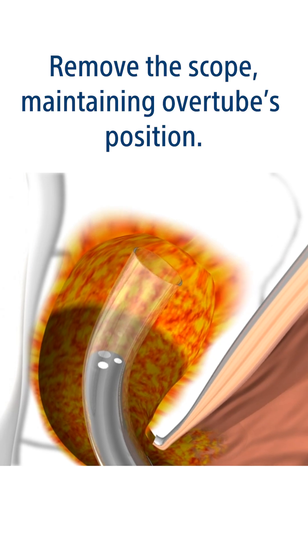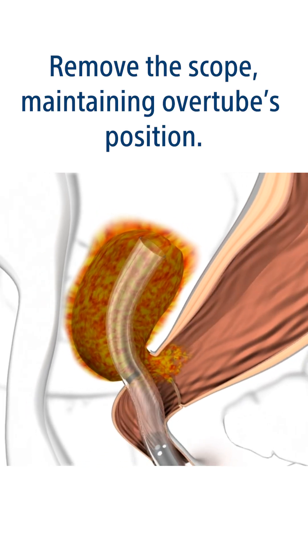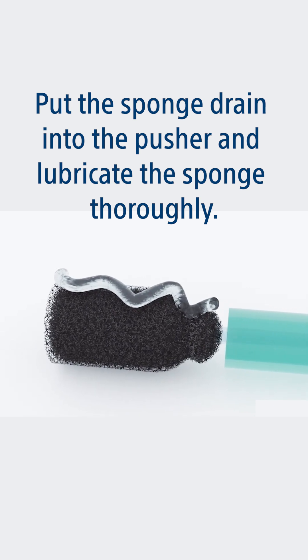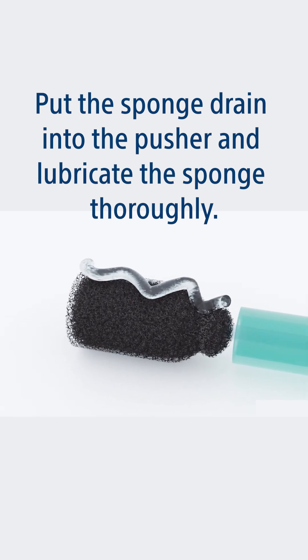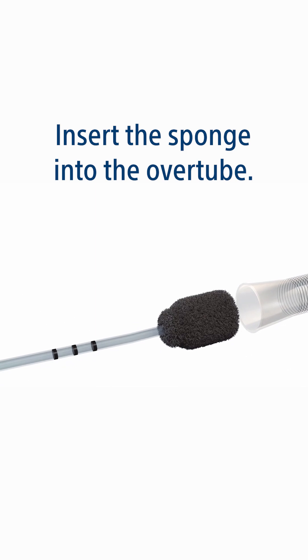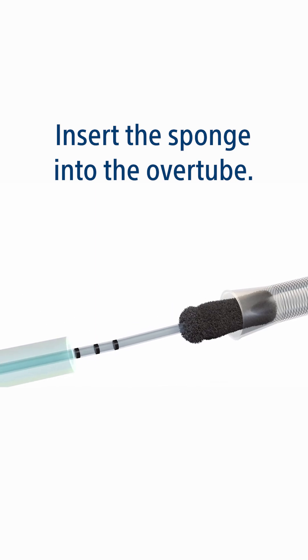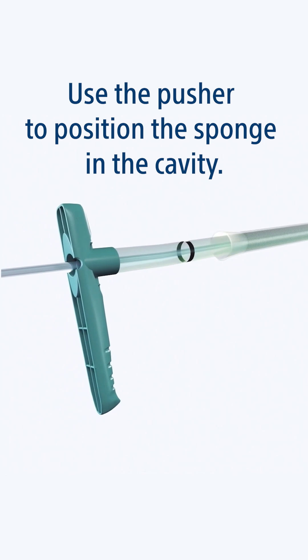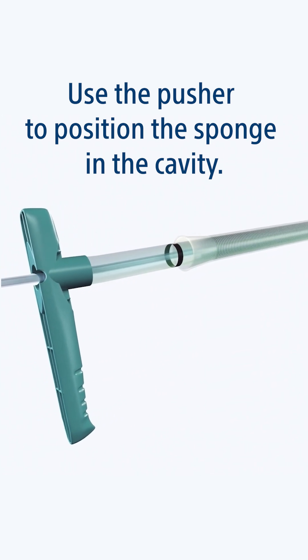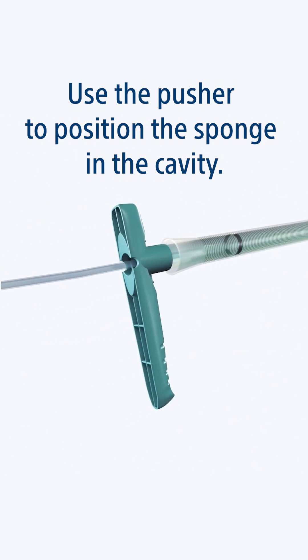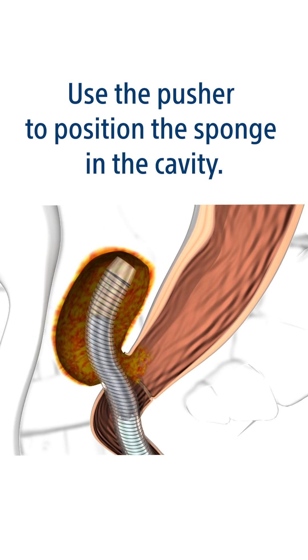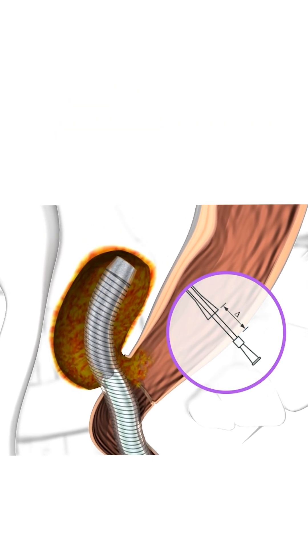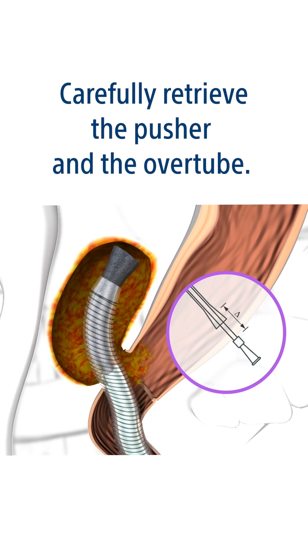Remove the scope while maintaining the over tube's position. Put the sponge drain into the pusher and lubricate the sponge thoroughly. Insert the sponge into the over tube, then use the pusher to position the sponge in the cavity. Carefully retrieve the pusher.